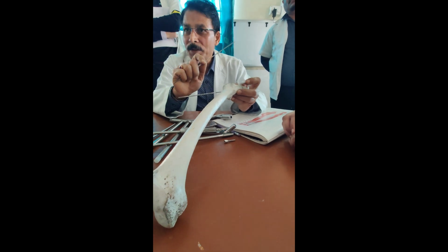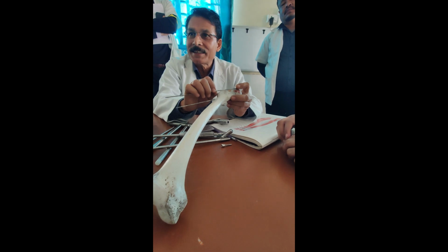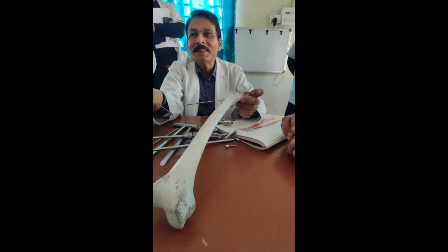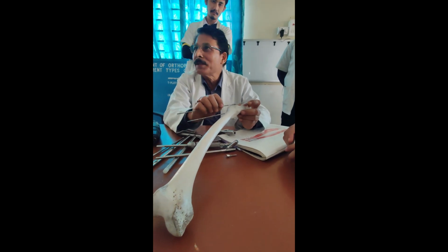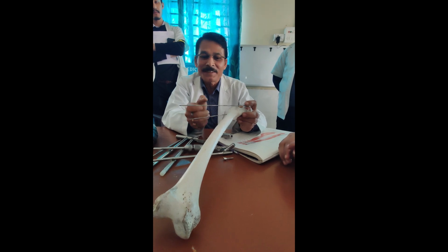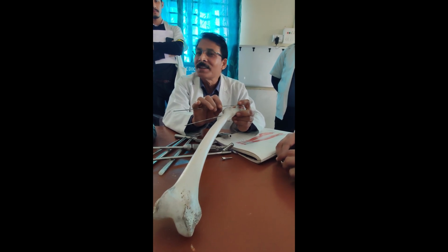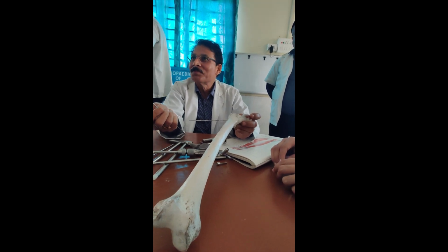The hole is big enough, so you know where the second guide wire is, and then you can take the artery forceps here, clamp it, and this is the direct one. Two techniques. So you can put another guide wire reversed here, since the hole is big enough. Then you can take the head measurement here. So this directly tells us the length of the screw.